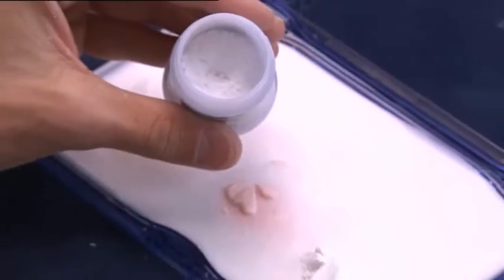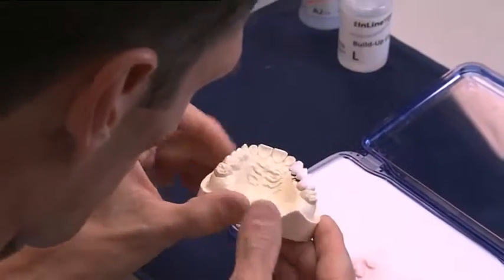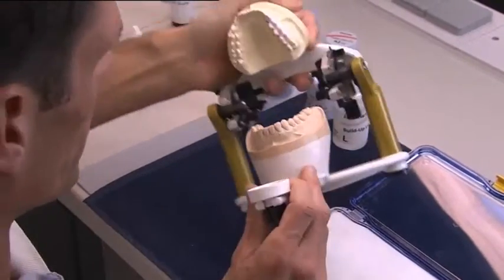Transpa incisal is mixed with the buildup liquid and applied from the incisal up to the incisal third and occlusal area in small portions. The anatomical shape is slightly over-contoured. The available space and functional occlusion are checked in the Stratos.